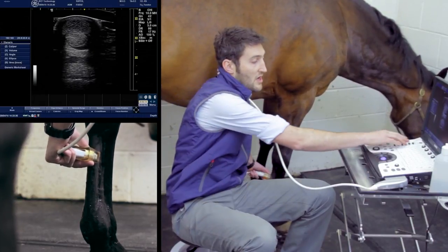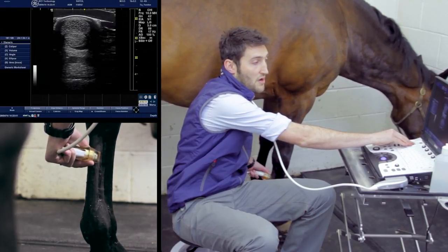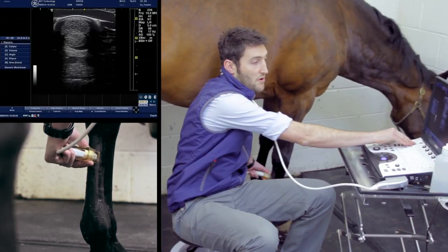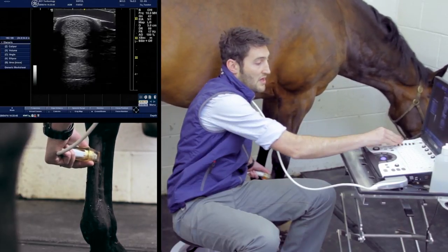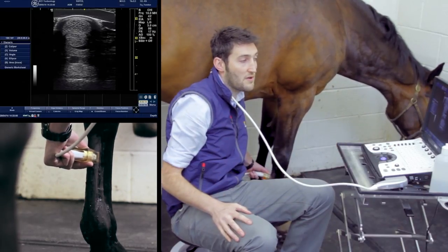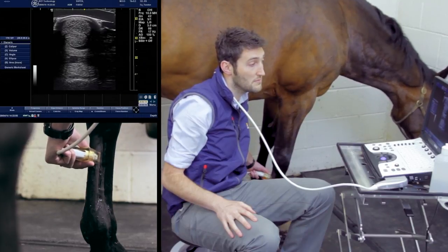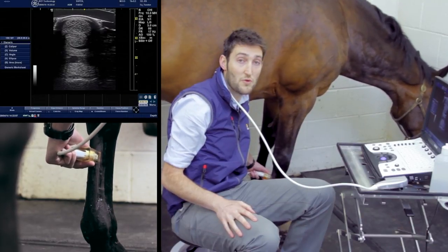It's a little bit dark at the top of the screen, so I can use the time gain compensation to brighten the top of the screen, and also just a little at the bottom as well. We now have a nice image that shows all of the structures we're interested in at good resolution.